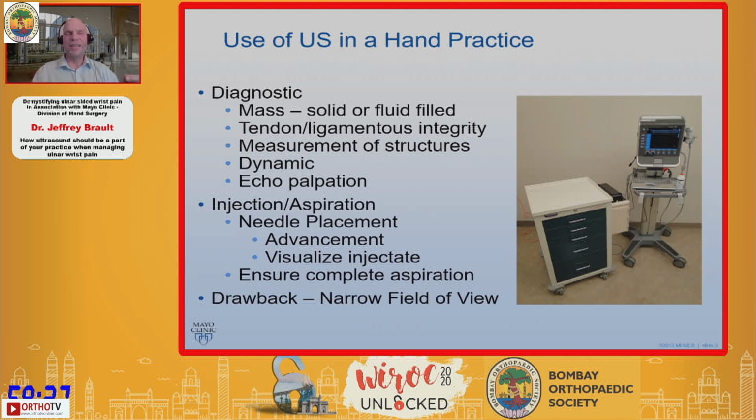Now, one of the things, as Peter said, after you do your history and physical, sometimes I like to use the ultrasound as an echo palpation. The patient identifies exactly where it hurts, and I can use the ultrasound to kind of scan over that region. We'll show you some of those pictures in a minute.